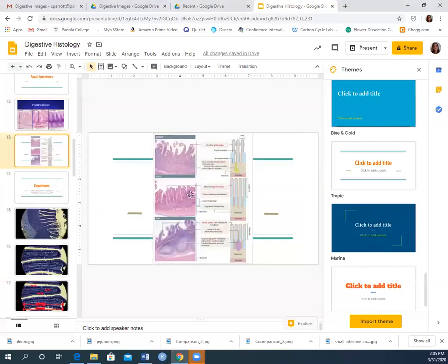Okay, here is another comparison of them. So you can see at the top is your duodenum, and see how you can see those little dried leaf bits that are flaking off. And the tips of these plica circularis, which are those large finger extensions, the tips of them on your duodenum a lot of times are a little bit pointier than your jejunum and ileum.